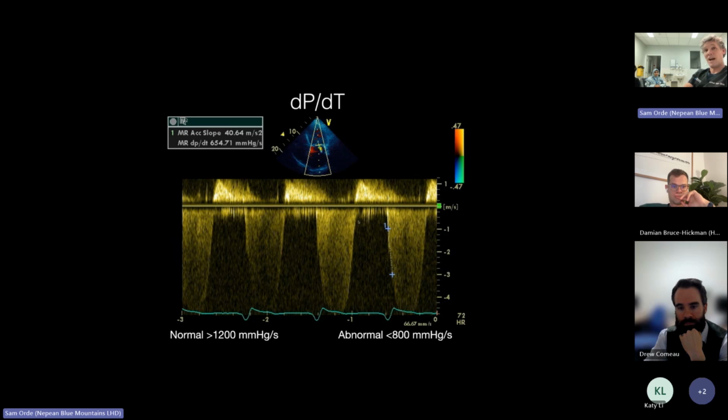And ideally what we should have is changing the scale. So it's just that scale that I'm interested in, of like 0.5 meters a second up to 3.5, and then I have the sweep speed as being super long, so that the measurement that I'm making is across the entire screen. You've got to be able to see that line nicely, and don't try and fake this number, and don't use it in isolation. I think would be the go. Nice.